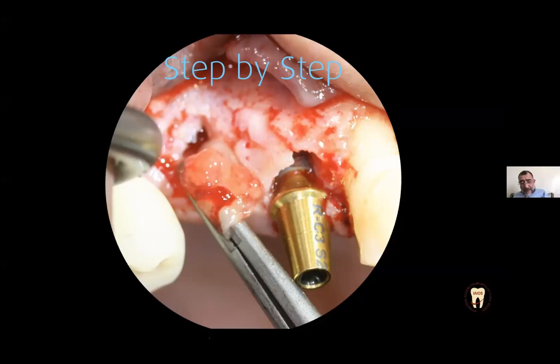If you have this problem with this technique, and you perforate your membrane, and you have to put bone graft into the sinus, you have to open a window and elevate your membrane, and you elevate your membrane quickly, and you don't have to make a big perforation into the membrane, and you have to glue a collagen membrane against your Schneiderian membrane, and put your bone graft before closing your sinus.